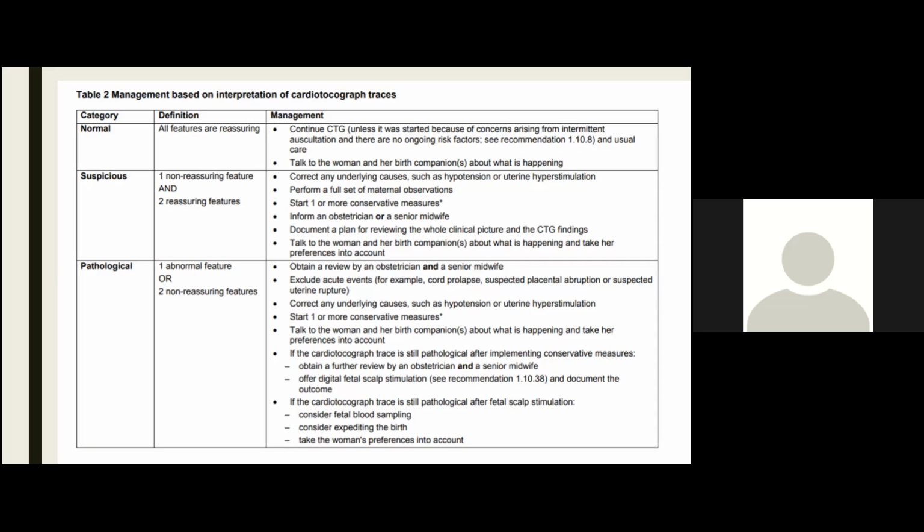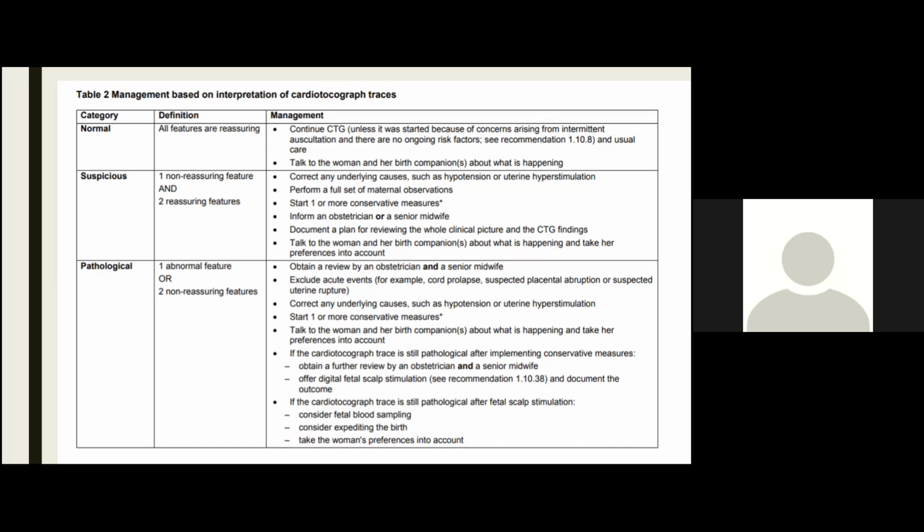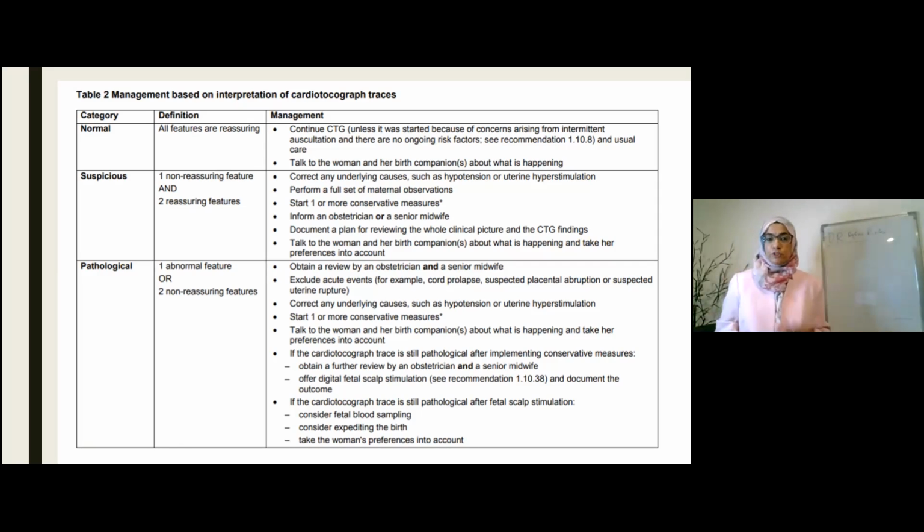There's another question here saying, what do you think of self-monitoring of pregnant women by CTG with devices for home use? That was started by Tom Cruise, is my information. Absolutely wrong. Never do that. There is no information out there for a woman to monitor her own baby with any gadgets that are out there. A good midwife without any gadgets is good enough to reassure a woman just by measuring her tummy, making sure that the fetal movements are good, and 2 or 3 scans during any pregnancy is enough for you to reassure you that everything is fine.